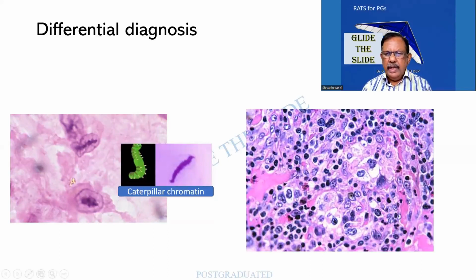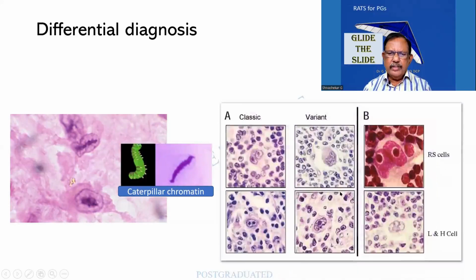On the other hand, I am finding a lesion with a pleomorphic population, and the organ or tissue cannot be identified. So I am finding some histiocyte-like cells, some lymphocytes. This my professor would like to call an effacement of architecture, in which I am finding a large cell with a large nucleus, and a few other large cells. If this is doubtful, look at this. I am finding a range of cells, binucleate and a mirror image. This is multinucleated.